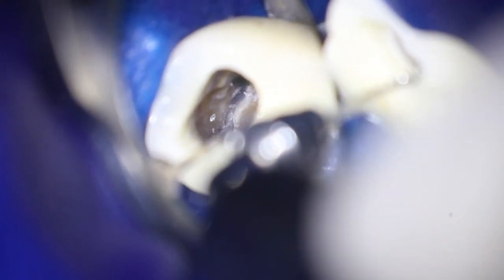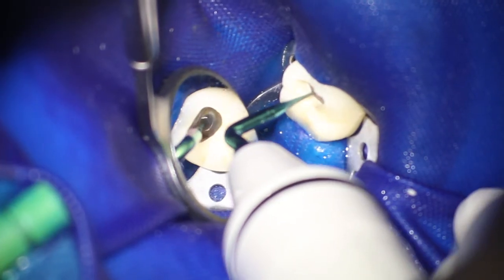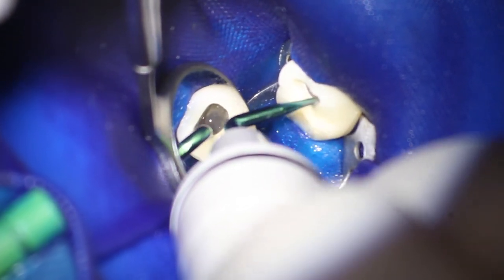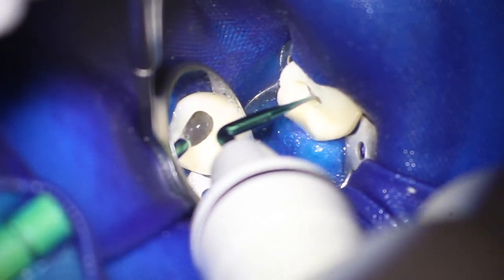You can see that also here ultrasound is a big help to create space, very specifically to save as much sound dentine as possible. Again, a careful irrigation is important here. Very careful irrigation not to overpress any sodium hypochlorite over the apex. And now I have a properly cleaned canal that is ready for filling with MTA.